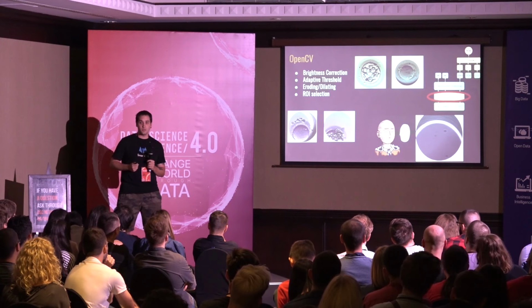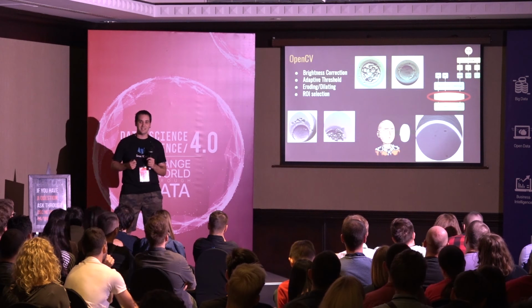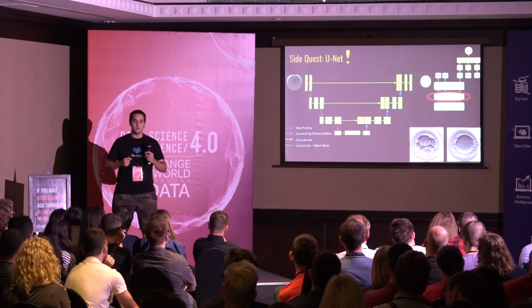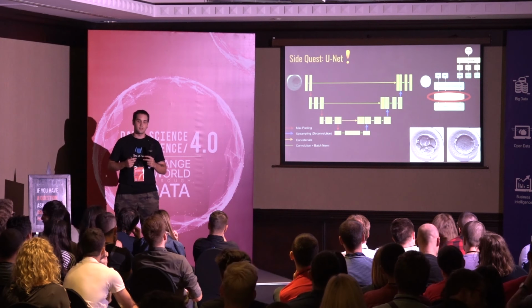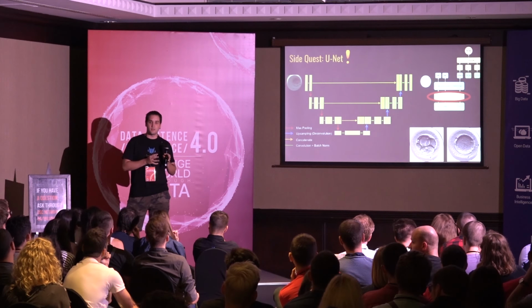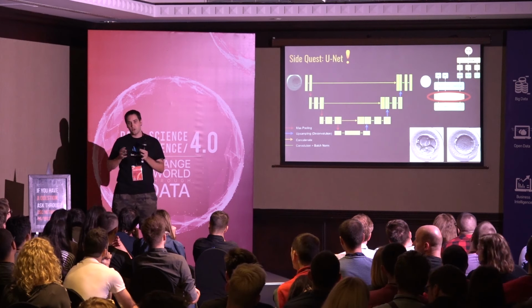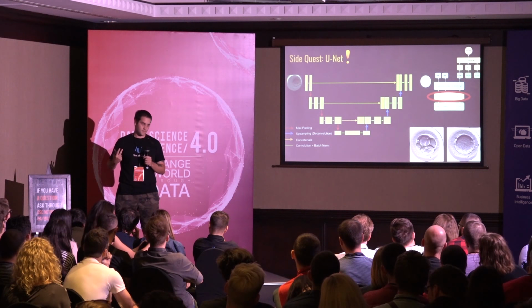But we used OpenCV to make a labeled data set for our first side quest today, UNET. We used OpenCV to create labeled images. On the one hand, we have raw embryo images. And on the other hand, which is the label, we have the binary mask for that embryo.